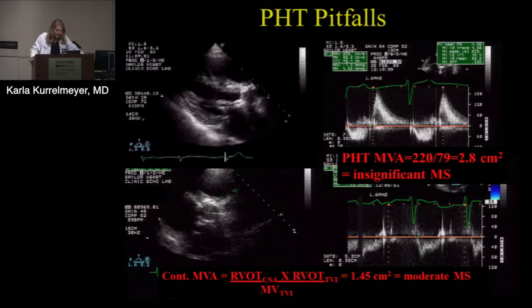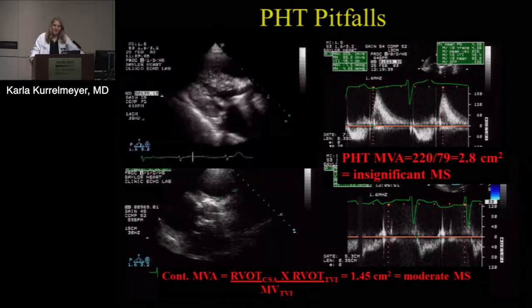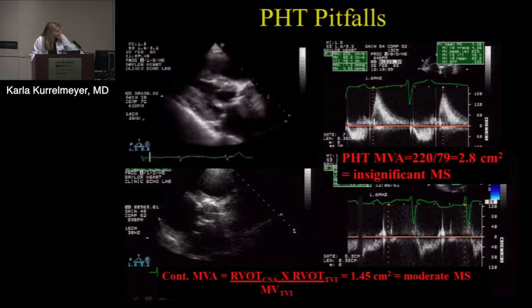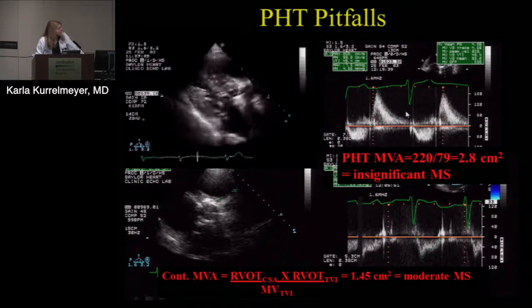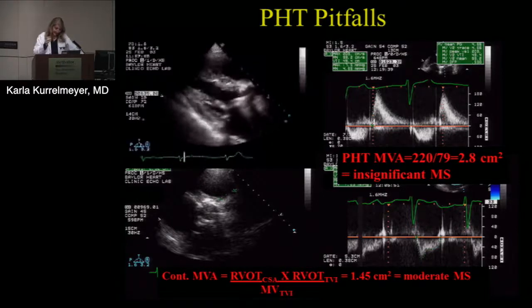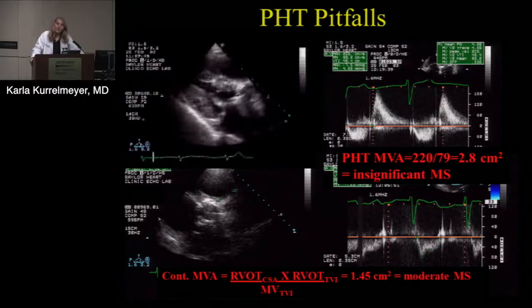So this is Dr. Cassie's patient that she just mentioned. This is somebody who has significant left ventricular hypertrophy. You can see they have a prosthetic aortic valve up there, so they have concomitant aortic valve disease. You can see that they do have mitral stenosis, probably rheumatic, because you see that nice doming of the anterior mitral leaflet. So I'm going to give this one to Dr. Cassie.